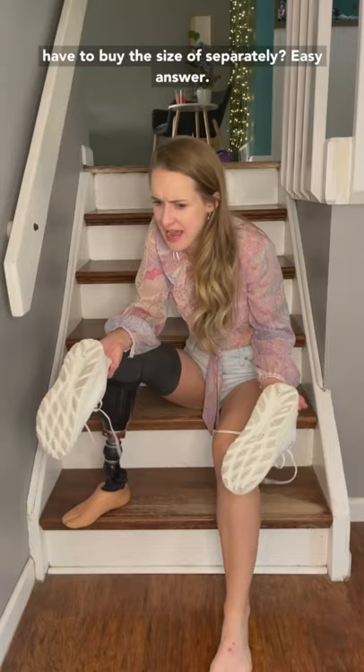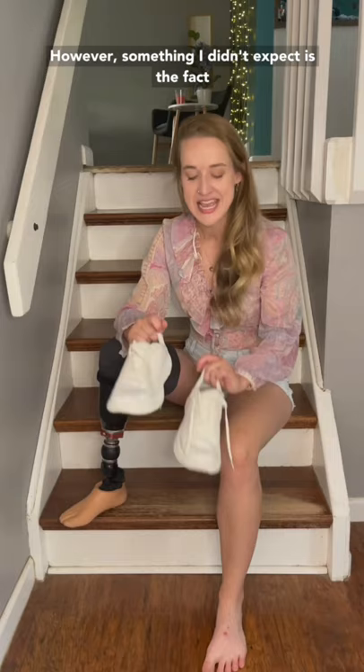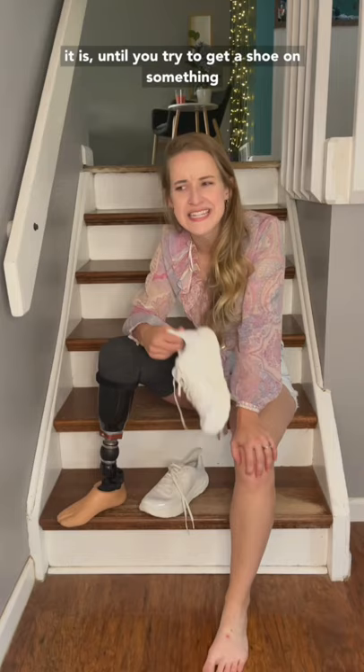Easy answer — when you are measured for your prosthetic, they do indeed match up the sizing of your prosthetic foot to the kinds of shoes you would normally wear. However, something I didn't expect is the fact that you don't really realize how much movement you have in your foot and how kind of squishy it is until you try to get a shoe on something that isn't either of those things.